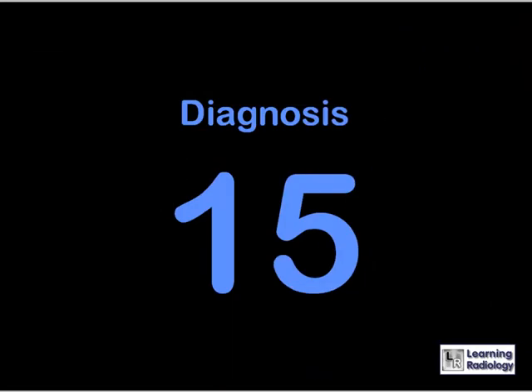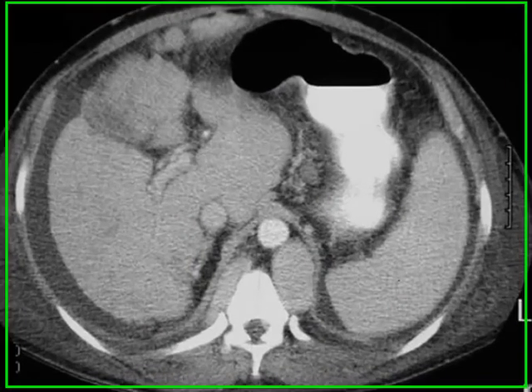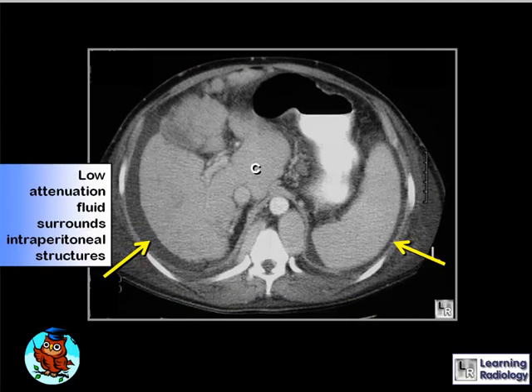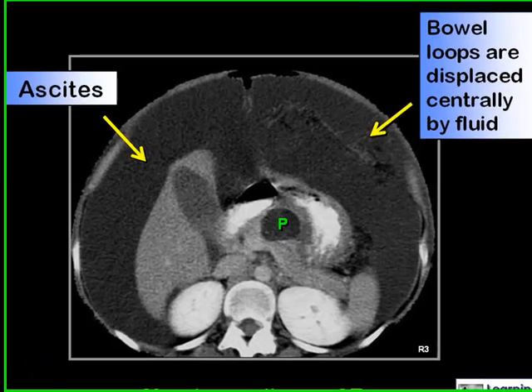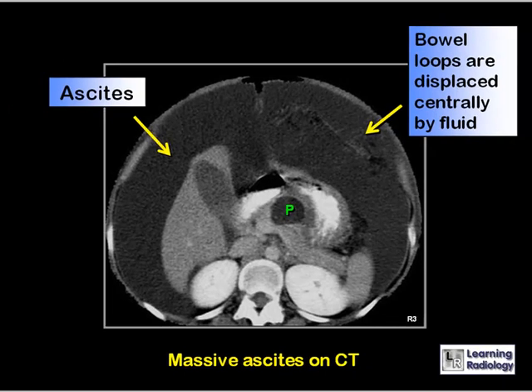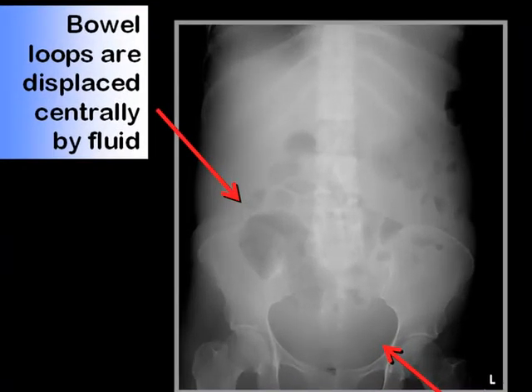This is Diagnosis 15, the last in this podcast. Why does this 47-year-old have increasing abdominal girth? There is low attenuation material surrounding the intraperitoneal structures such as the liver and spleen — this patient has ascites from cirrhosis, with an enlarged caudate lobe. Another example shows more massive ascites with bowel displaced away from the abdominal wall by the fluid, and the letter P represents a pancreatic pseudocyst in a patient with pancreatitis. On conventional radiograph, ascites may be recognized by displacement of bowel loops centrally in the abdomen.